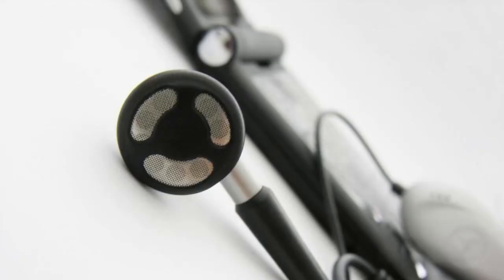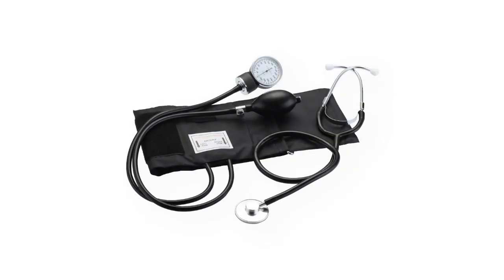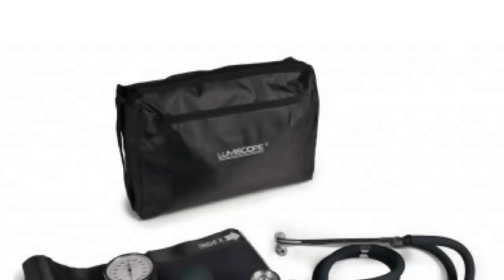The cuff is designed to fit comfortably on the patient's arm, providing accurate blood pressure readings. The stethoscope is equipped with multiple chest piece attachments, allowing for precise auscultation of various sounds in the body.